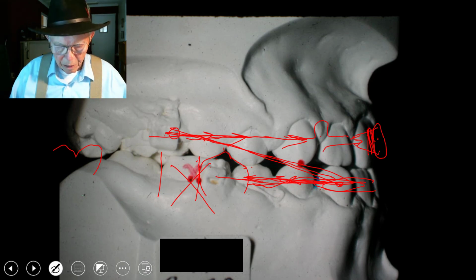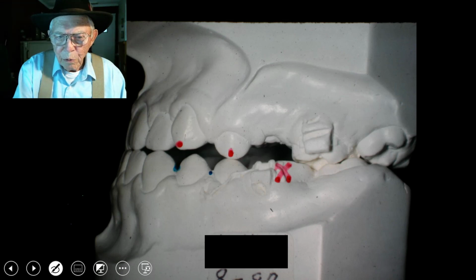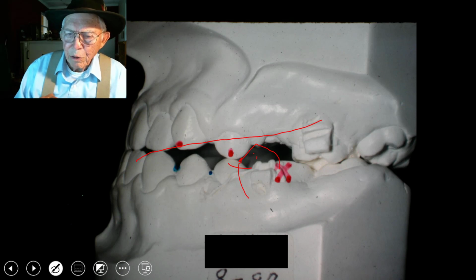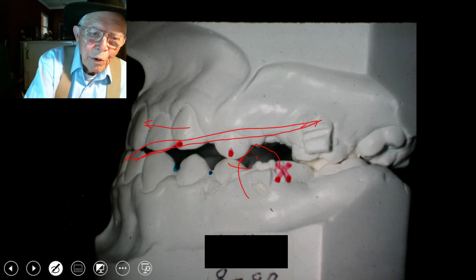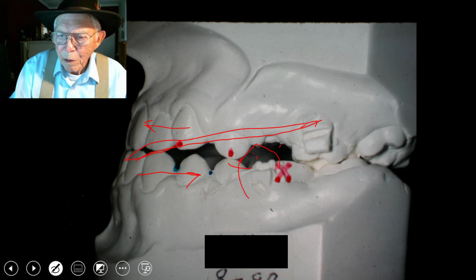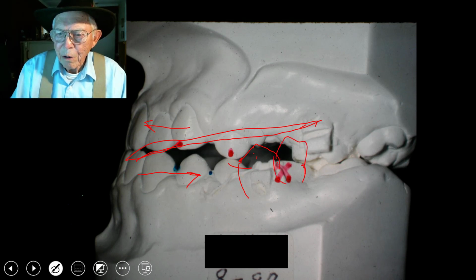Now, let's go back, and I'm going to erase that, and we'll show the other side. The mouth is almost exactly the same way. So we're going to try to bring this bicuspid up underneath here and have it that way. And also we're going to be pulling forward. In other words, we're going to be using class 3 elastics now, pulling these teeth forward. So this will move these teeth in a forward direction, and it'll move these teeth in a backward direction, and we'll pull these teeth till we get the class 1 relation with the bicuspids all the way back to the back of the mouth. The first and second bicuspids will fit right in that area, right like that.